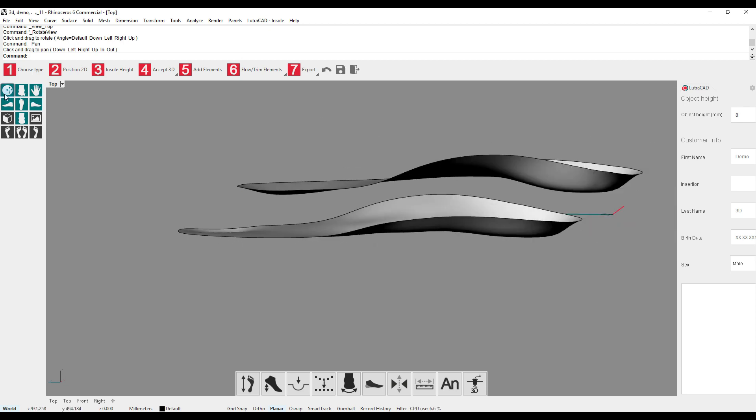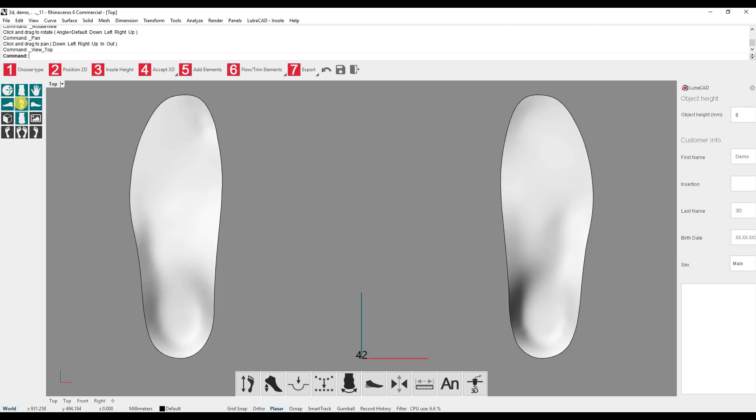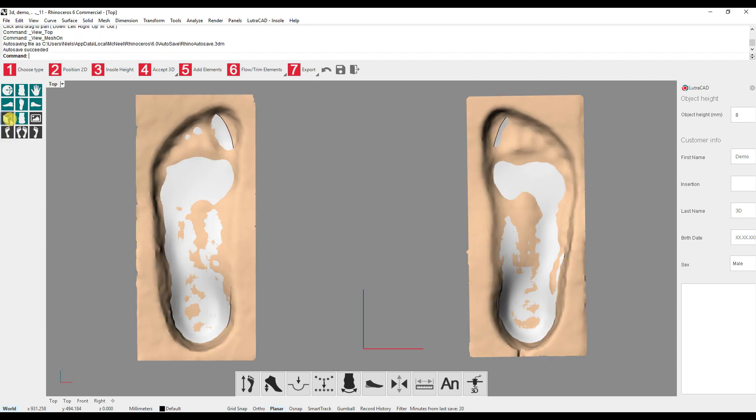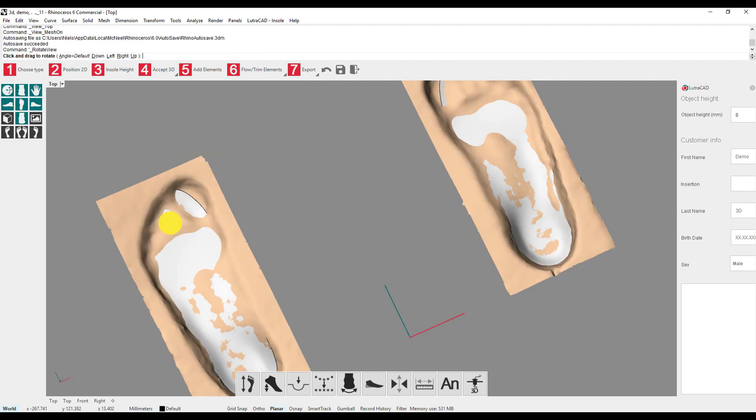Now that we know how to move around in LutraCAD, we can look at which insoles and scans are visible in the document and how to switch to transparent view. For this, we use the dark gray buttons. We can show the 3D scan by left-clicking mouse button and hide them by using the right mouse button if we have loaded a customer scan.